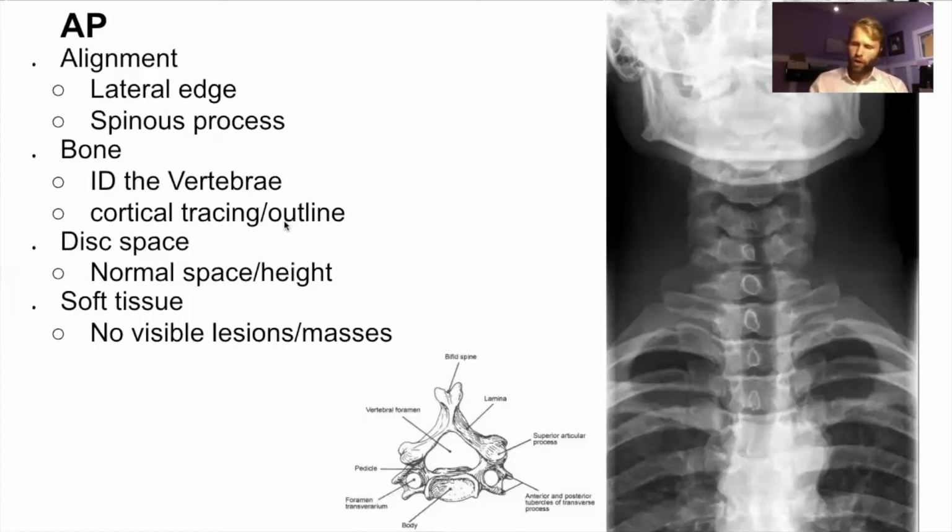One of my instructors several years ago found a Pancoast tumor, I think, looking at a neck X-ray, by the way. So just make sure you look at the whole structure and have a systematic approach of how to go through it. But you know, to each their own, whatever works for you.